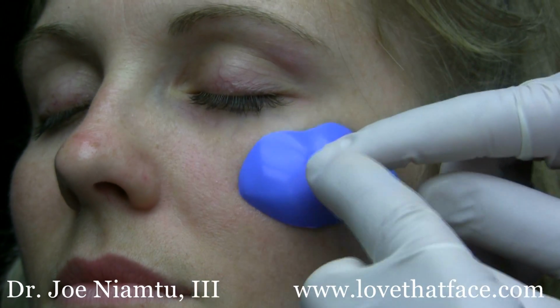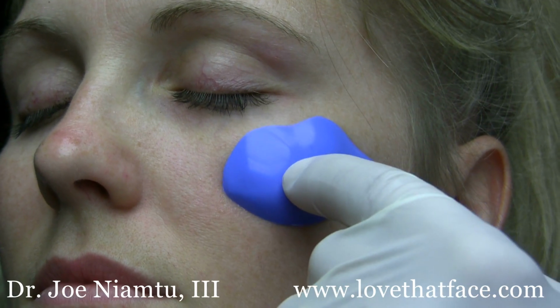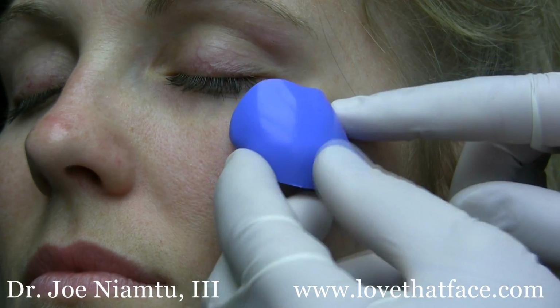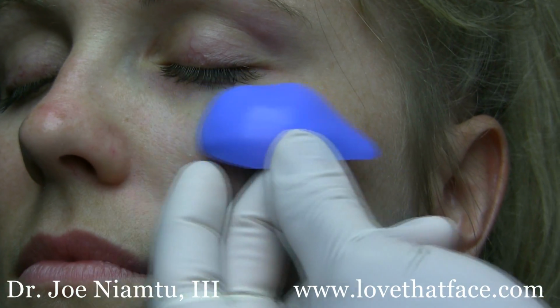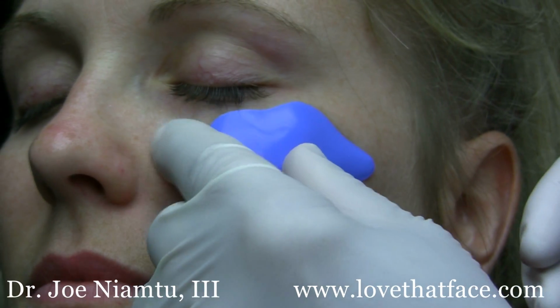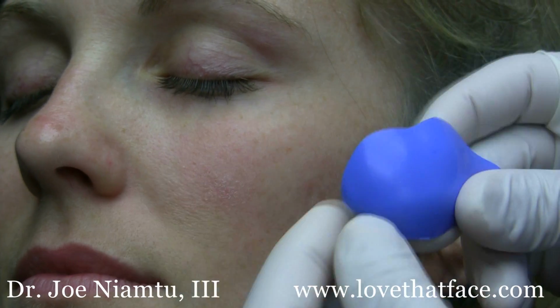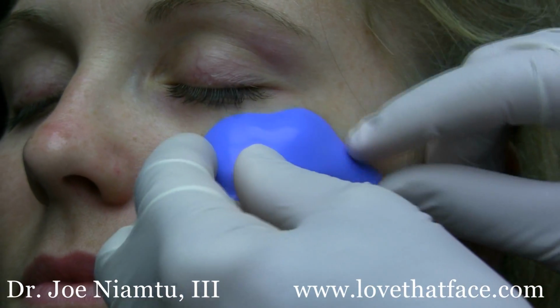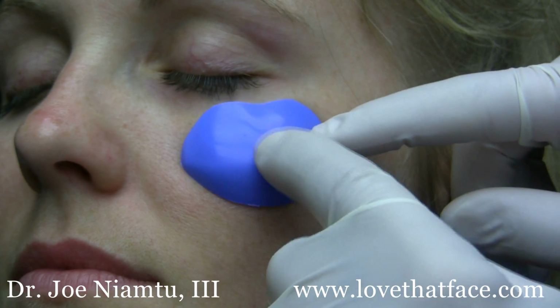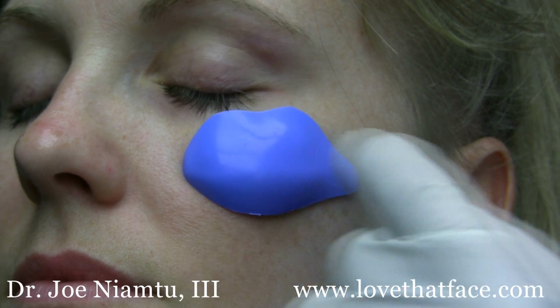And this is a big implant, and again, I don't use it that much because most people don't need augmentation way out here, and you have the option to position this. You also have the option to trim any of these implants. So experienced surgeons will customize the implants and trim them down, but I find very few instances where I need to fabricate a computer-generated custom cheek implant because these are so versatile.